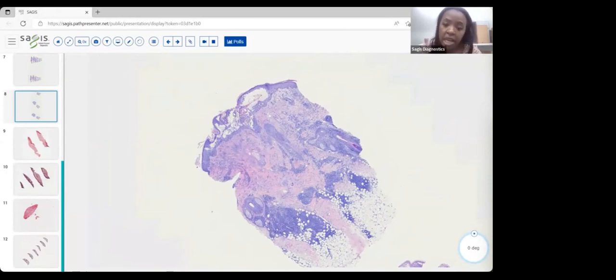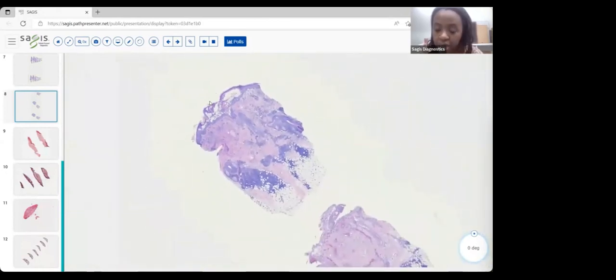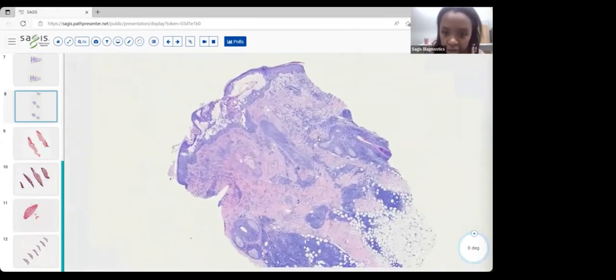So herpes zoster. So a couple of interesting comments and notes about herpes viruses in general, and then herpes zoster in particular. So first of all, this inflammation, we did not get this kind of inflammation with the papilloma viruses, right? We did not get this kind of inflammation with Verruca. And we talked about immune protection of a sort, so just being limited to the higher epidermal areas, while with HSV, VZV, you're not getting that. The cells are bursting, right? They're filled with viral particles. The keratinocytes are filled with viral particles, and they burst.